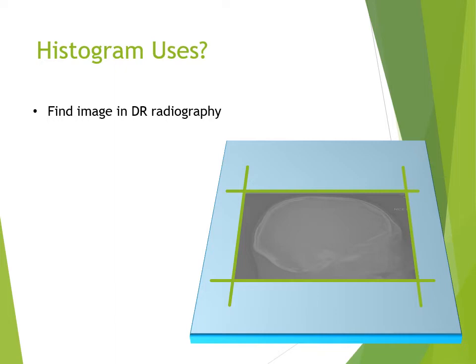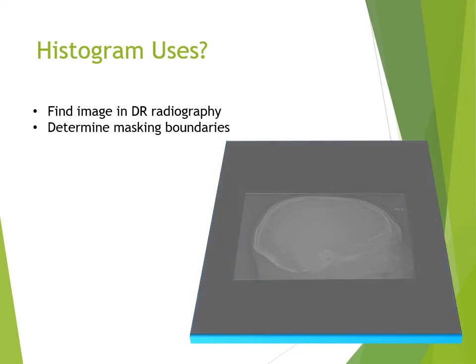If the radiograph were restricted to pixels used to capture the finger's image, file size would be reduced by that amount. Just envision how a PA finger would appear if displayed in a 14 by 17" frame. Most DR and CR systems automatically mask images. This provides a black border around the collimator margin. Getting rid of the large white border surrounding the smaller images will reduce eye strain for the radiologist.